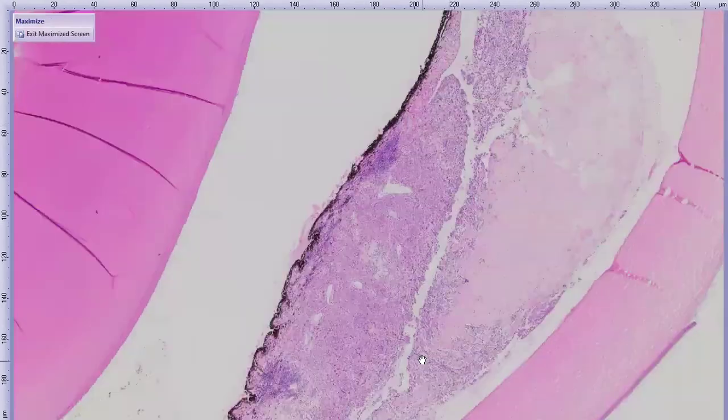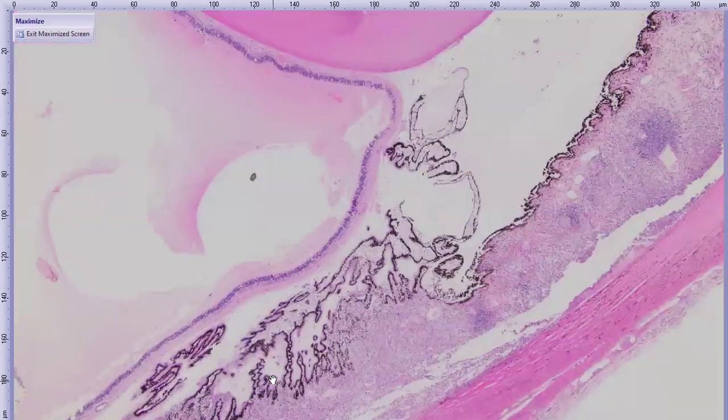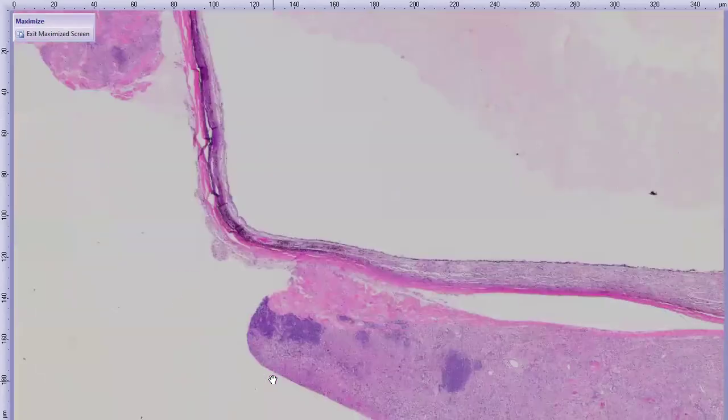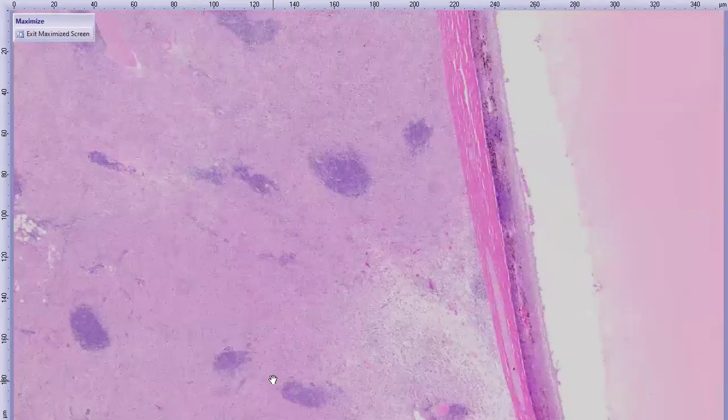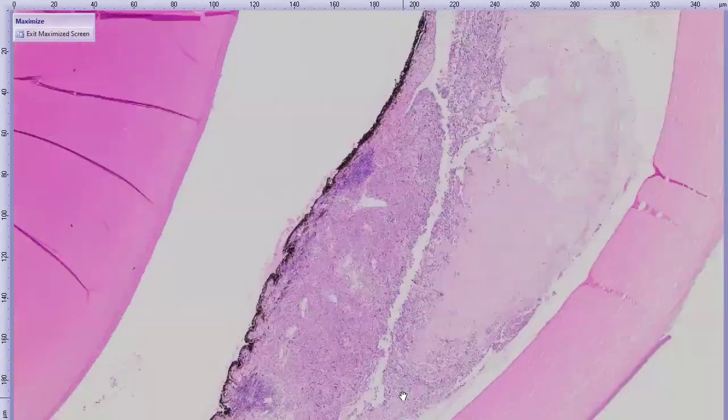So yes, we have the cellular infiltrate in the anterior chamber. As we get closer to look more at the uveal tract, not only are there these very purple cellular infiltrates, but the rest of the stroma itself also looks quite busy, corresponding to a pretty dense cellular infiltrate. There are cells in all of the layers of this eye. As we go back, there's more in the orbital adipose, it's in the choroid, so there's a panuveitis, with some cells floating in the vitreous. Now let's actually look at them.